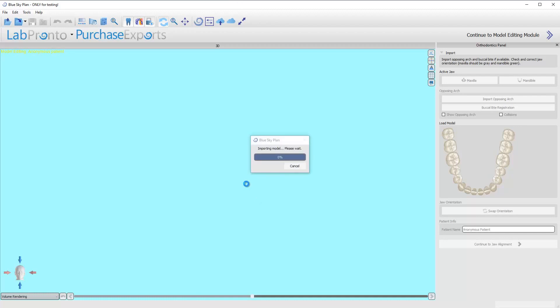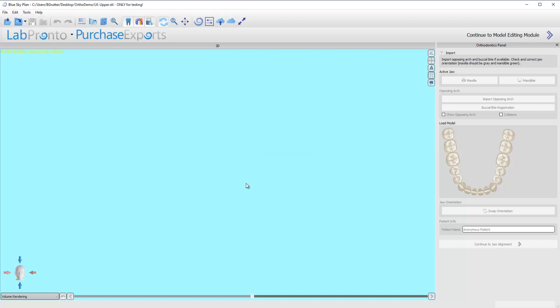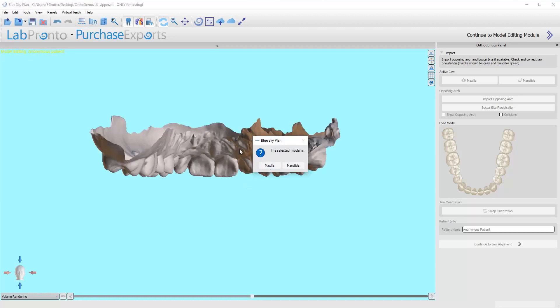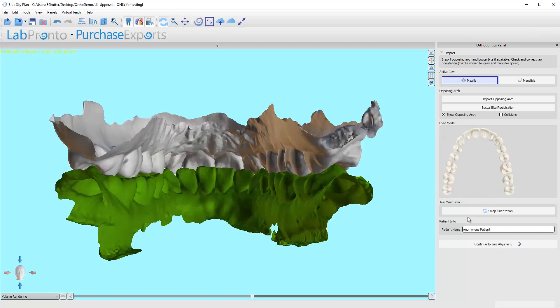Now it's going to process this for a second and then it's going to bring up one of the models that it thinks is the maxilla and it's going to ask me is this the maxilla or the mandible. And this is important for us to tell it otherwise it's going to flip it upside down. So this is the upper model. I'm going to call it the maxilla. OK.